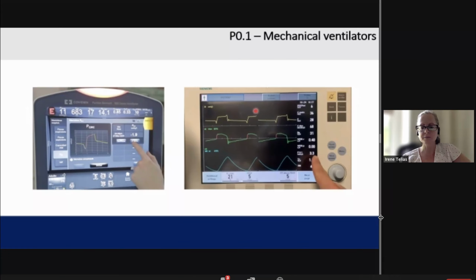Other ventilators, mainly the servo ventilators, do not perform an occlusion. They just give you the value of the drop in airway pressure during the trigger phase of the ventilator, extrapolated to 100 milliseconds. What is the good and the bad? So the good thing is that it gives you a value by breath, every breath. And the problem is that it might underestimate the real value if patients' drive and effort is too high, okay? Most ventilators do the measurements like this.